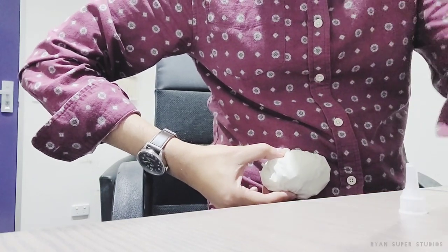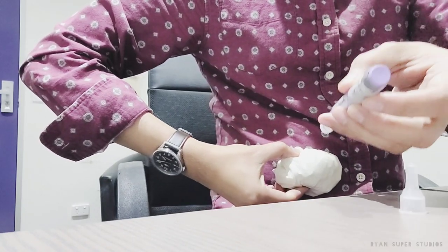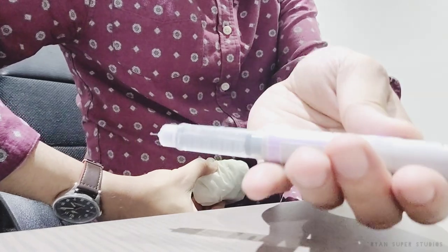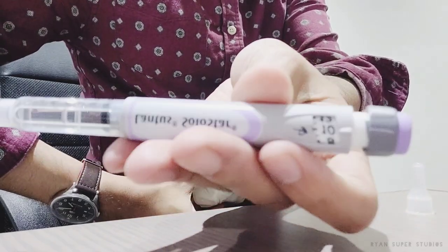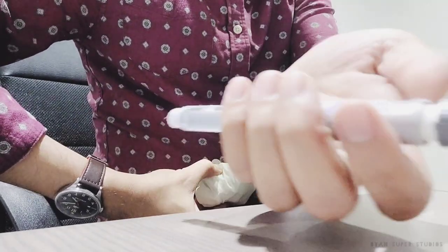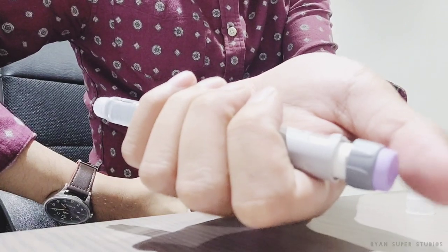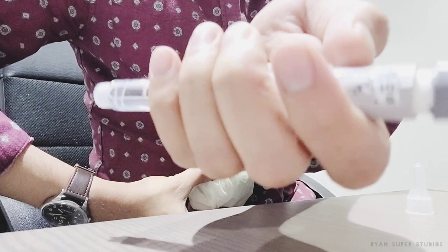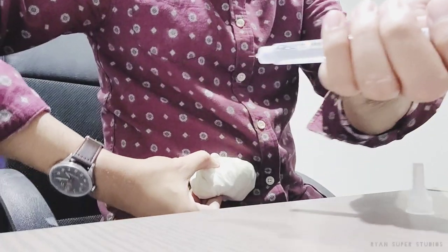You've dialed your dose to 10 units — the arrow is pointing at number 10. Hold the pen with your four fingers, and make sure the window is facing you so you can see whether you've given the full dose. Use your thumb to press the head of the pen and keep pressing until the number zero appears in the window.